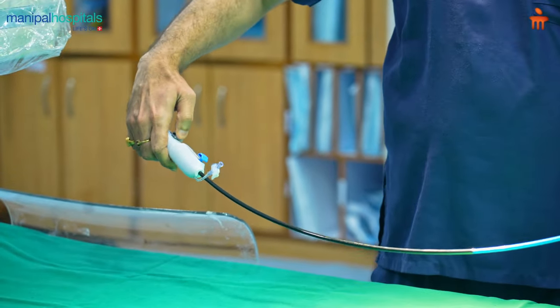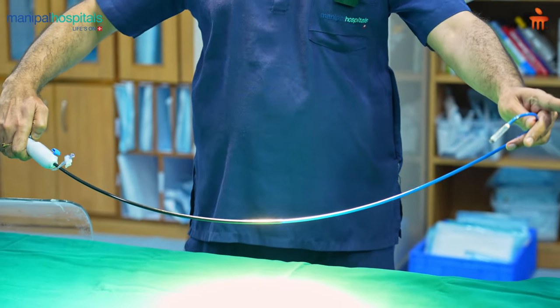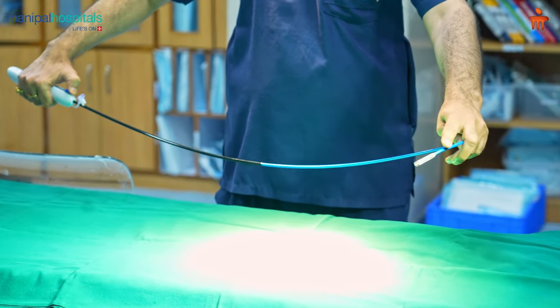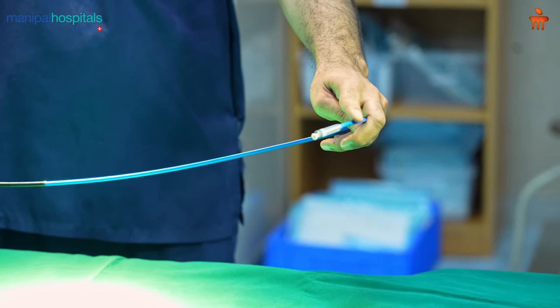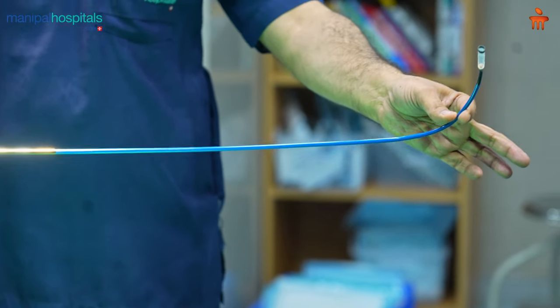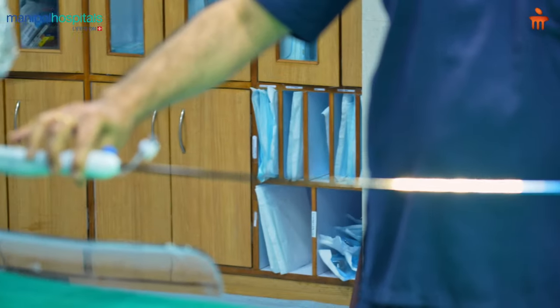You can bend it and put the device at the desired place in the heart. This is a delivery system which comes out and puts the pacemaker into position — this is the delivery mechanism. It's a very simple, single operator-driven device and delivery system which can be used.